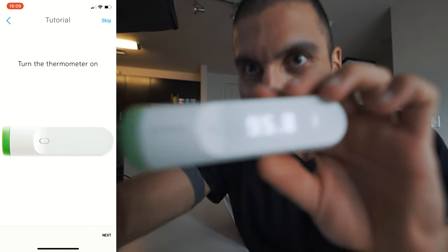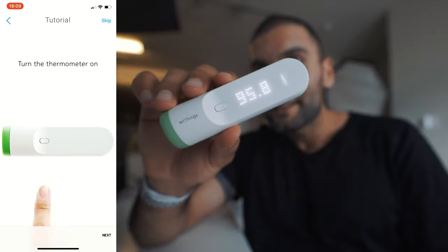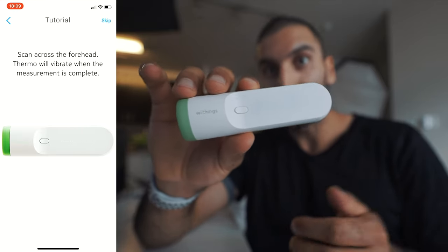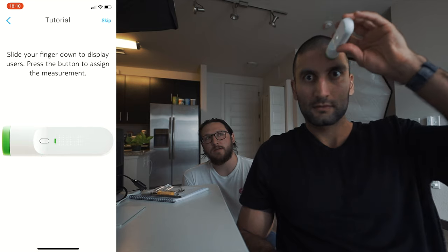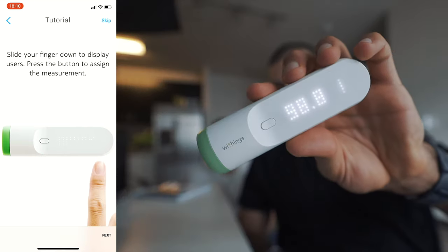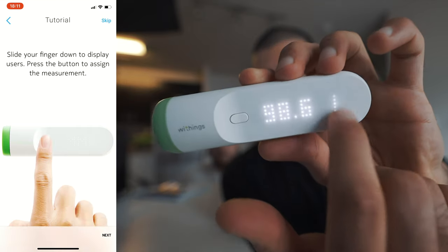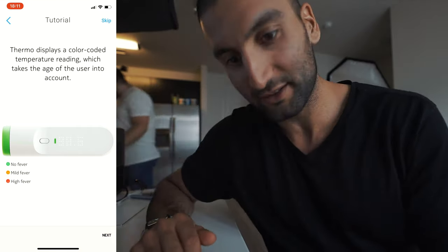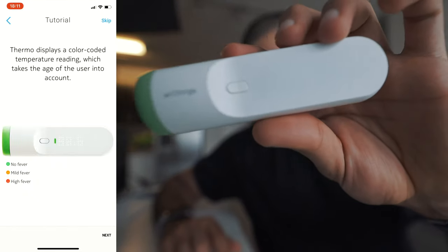You probably have to press it, then it scans. 98.8 — there's my official temperature. Shervin. Thermo displays a color-coded temperature reading. So I'm green. I'm in the green — that means I can go out and do things.